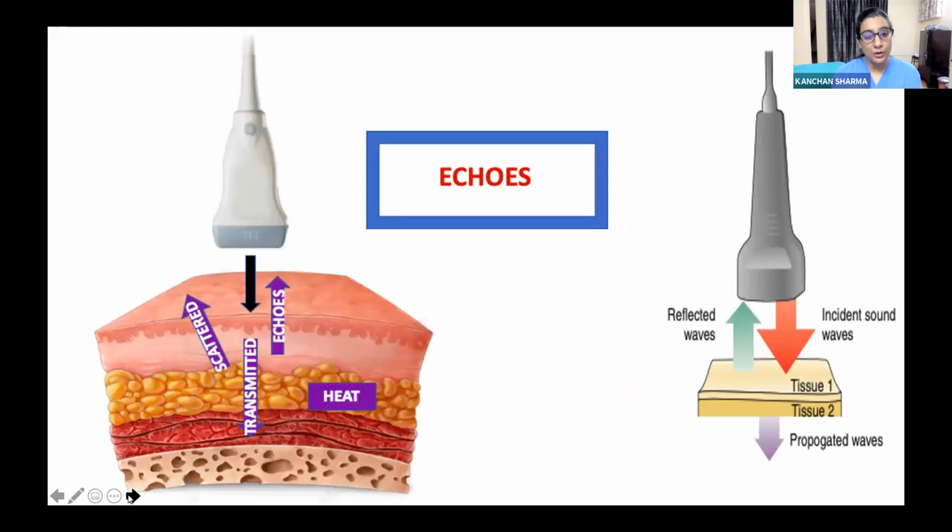What is important to us in ultrasound is the echoes. Echoes means, we have learned in our previous slide that ultrasound is generating a sound pulse wave, which is a sound wave.